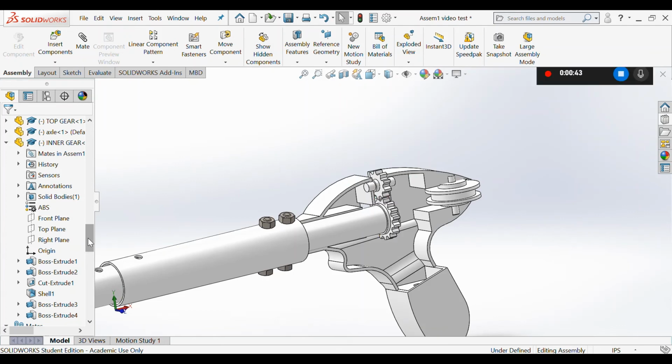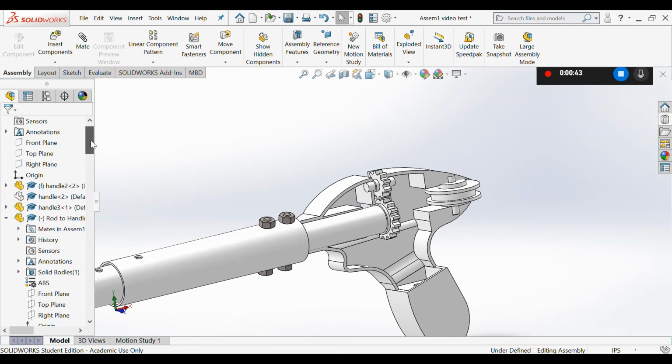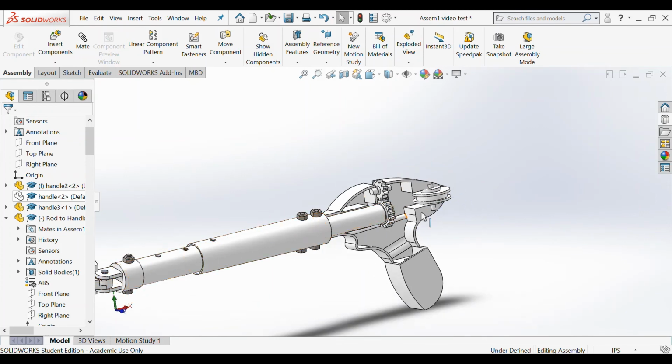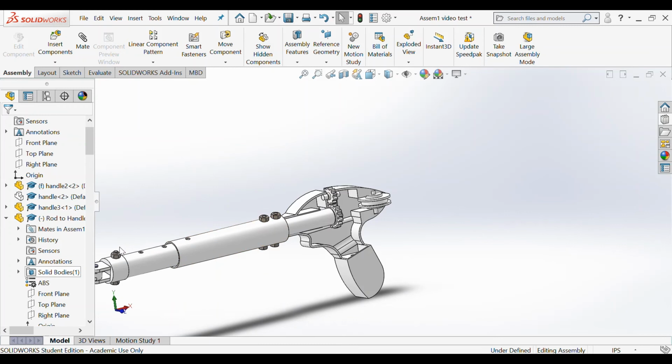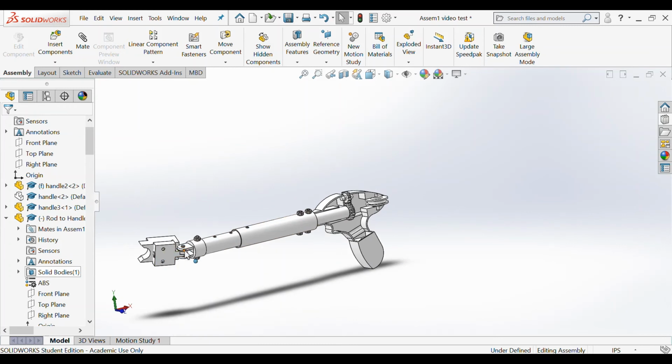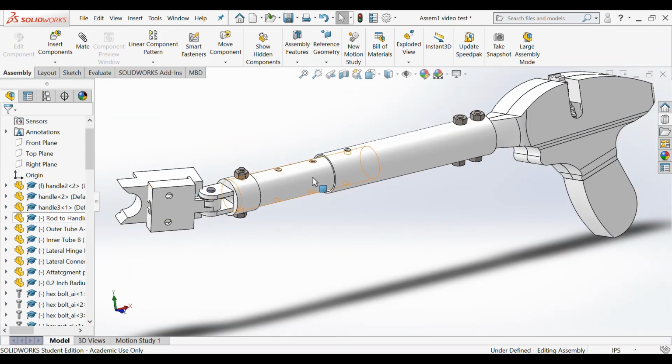So now we can go on ahead and move the handle piece to be seen. This piece right here is where our band rotates around, and it goes through this rod piece all the way up and connects onto this piece right here. So we're going to go ahead and make this handle visible once again.